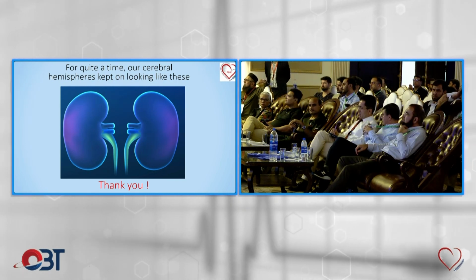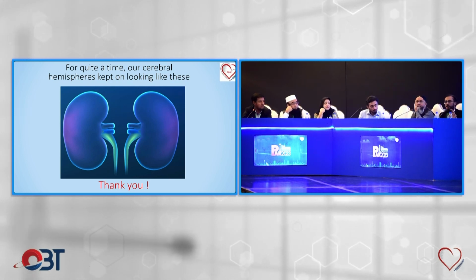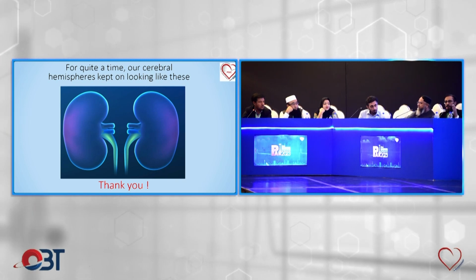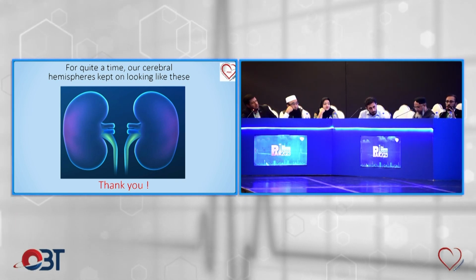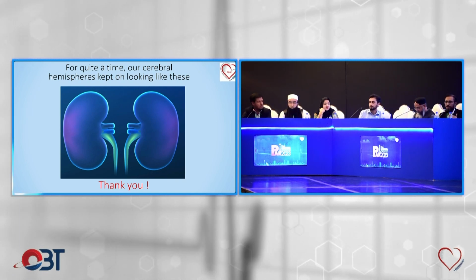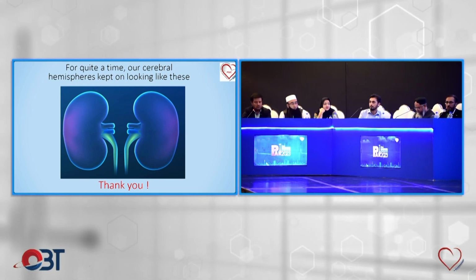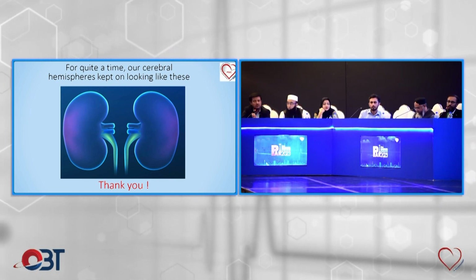You can use a little contrast for the patient's sake. And if there's any need, we can use contrast at 5 ml per kg of body weight divided by the patient's creatinine. This has been done in the Poseidon study as well, and we can continue the hydration period post the procedure. So we can use a little contrast in this type of patient. We can always use contrast in the patient.